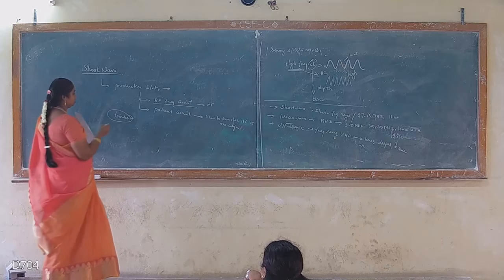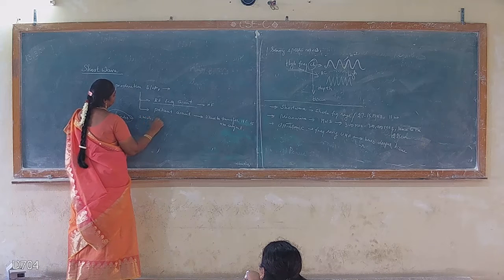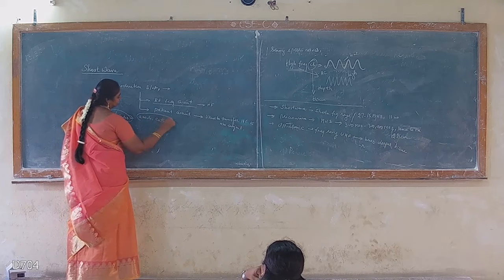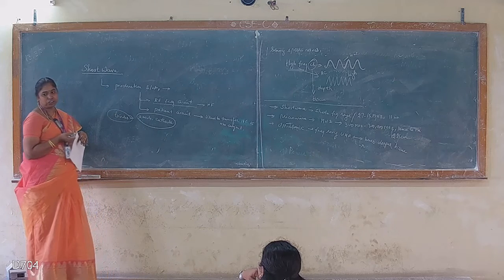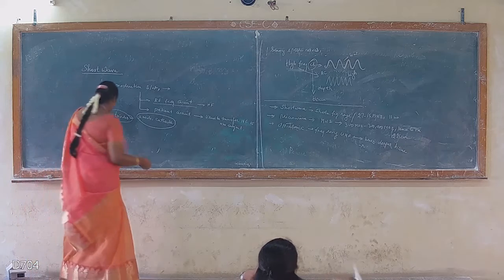Triodes means it consists of an anode as well as a cathode. By energizing the anode and cathode voltages, we are able to produce a very high current. So first let us take the circuit.